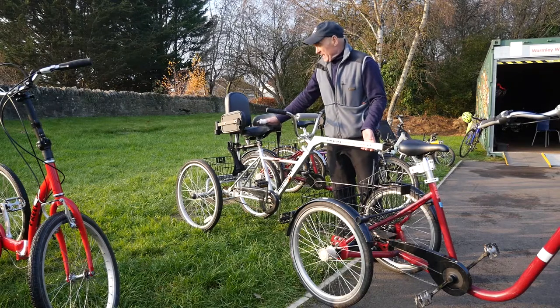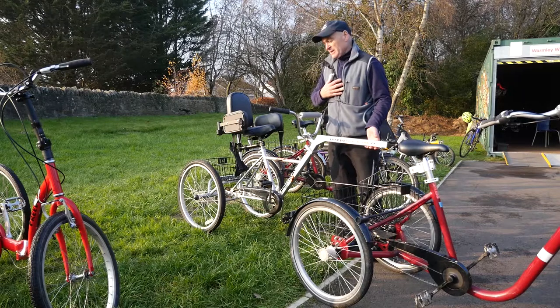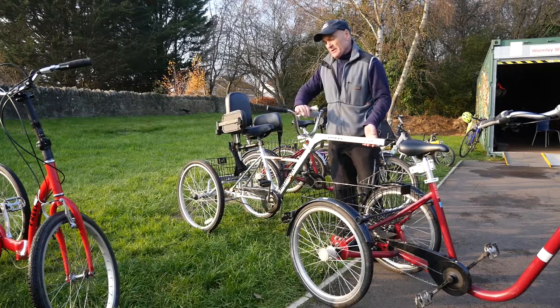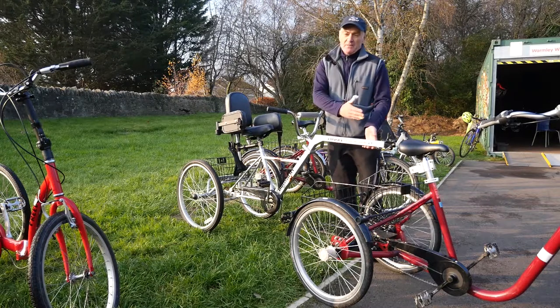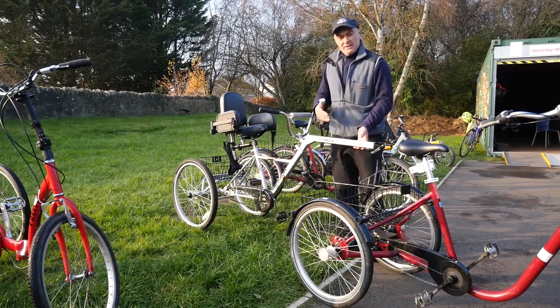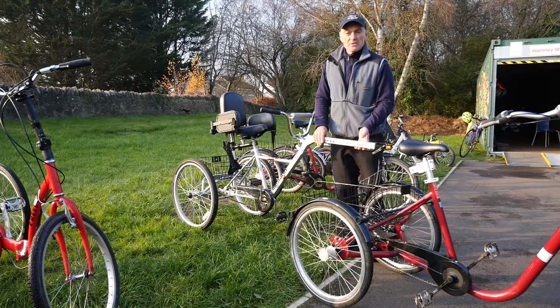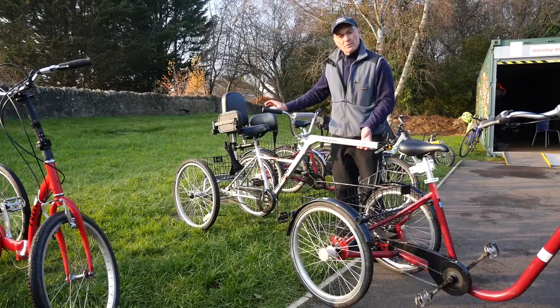If the service user is passive and content to be at the back, everything's fine. As long as they can sit upright — there are shoulder straps and a harness to keep them stable — and can support themselves with the handlebars, this works well. For the person cycling, it's just like a car with a caravan: you need a greater width when going around corners. It really is as simple as that, but the service user needs to be selected appropriately.